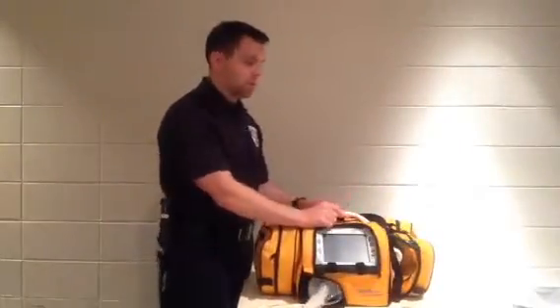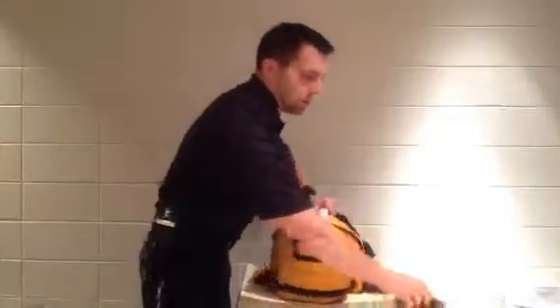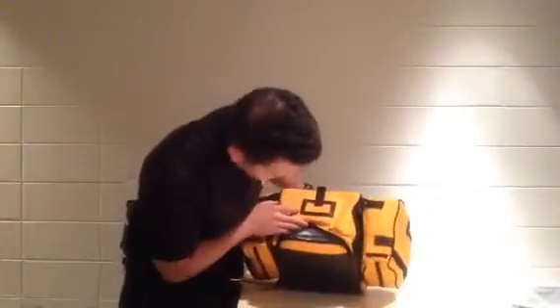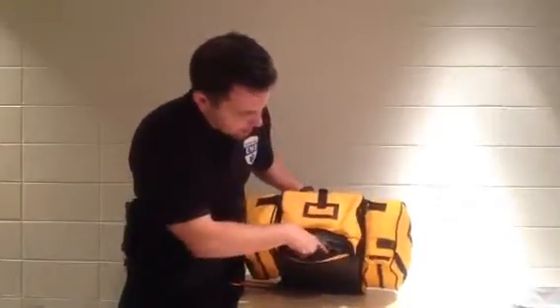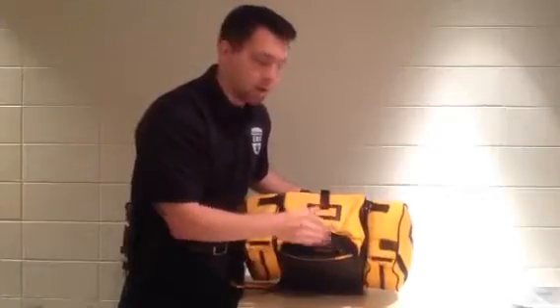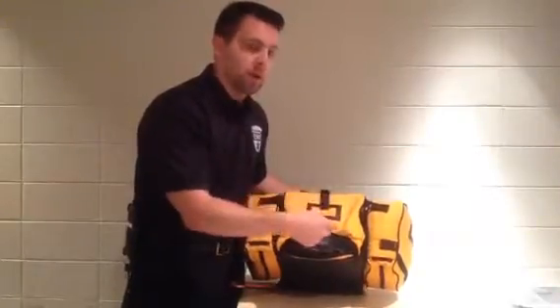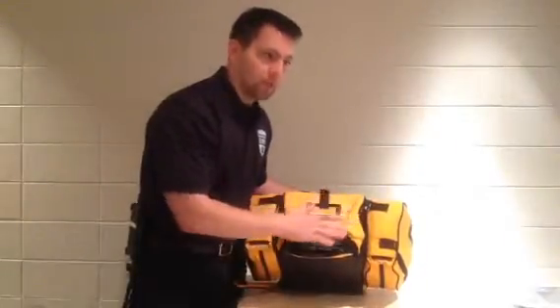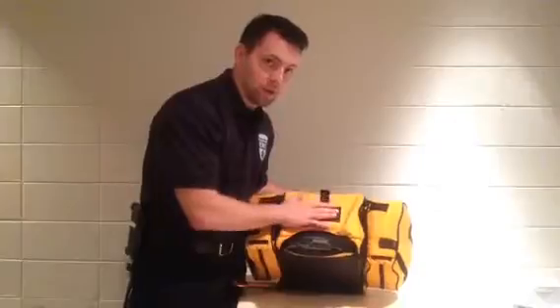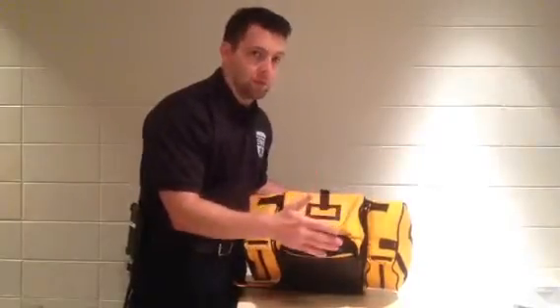The on/off switch is in the back of the unit. It's a black rocker switch that has a little raised section to protect it from accidentally getting rocked. It has a triple protection mechanism so that if you're ventilating a patient it's almost impossible to accidentally turn the device off and therefore leave the patient without ventilation.